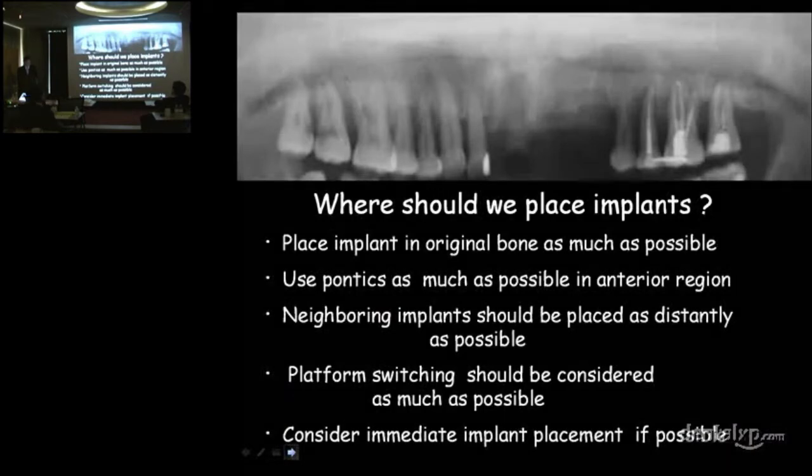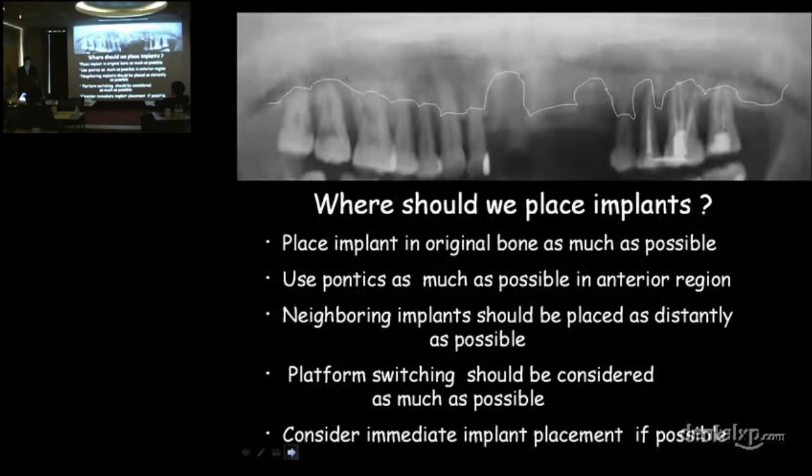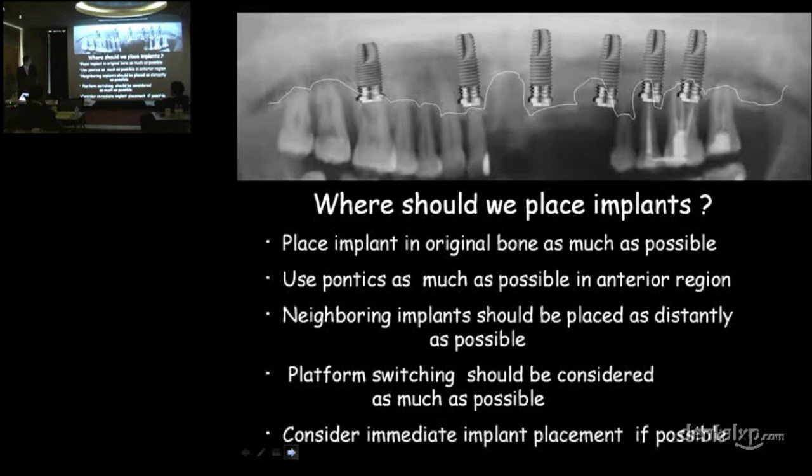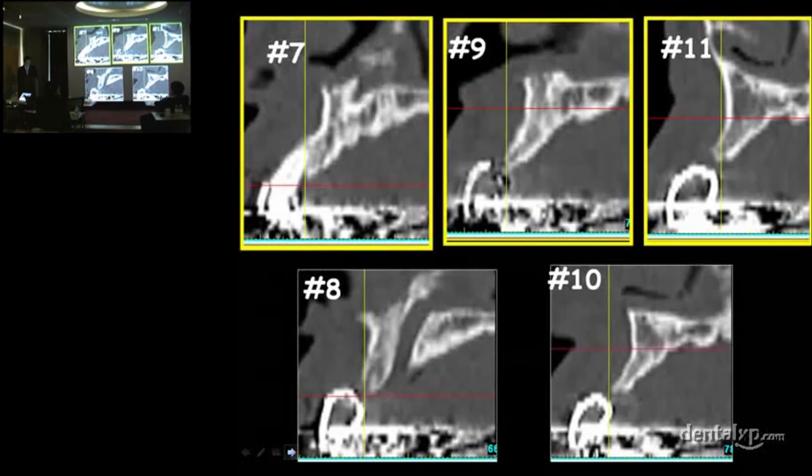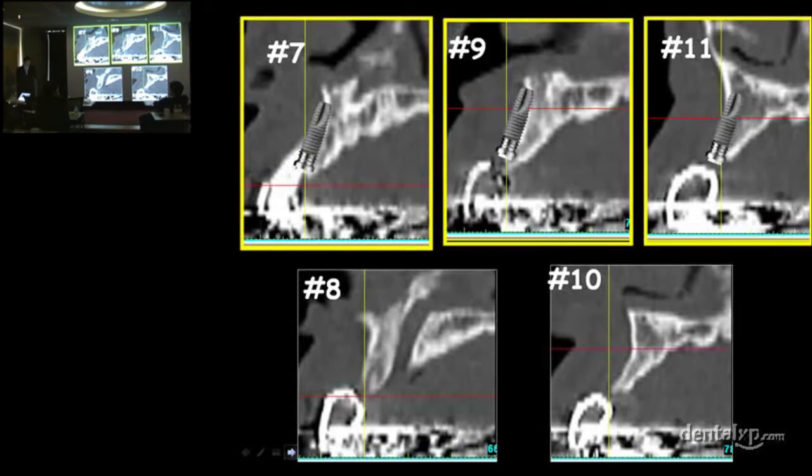Talking about the 3D multiple implant solutions, I plan to place these implants following the guideline. These are cross-sectional images. The yellow boxes are planned implant sites. Considering the 3D augmentation requirements, all 3 sites need bone augmentation to some degree.